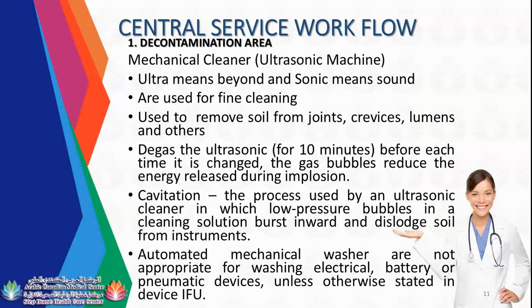The second part in your decontamination area is cleaning using an ultrasonic machine or mechanical cleaner. I will show you later what the ultrasonic machine is. An ultrasonic machine is a small tank for a small medical center, but there are big tanks or big ultrasonic machines in hospitals. Ultra means beyond and sonic means sound. So this machine cleans the instruments using sound waves. These are used for fine cleaning.